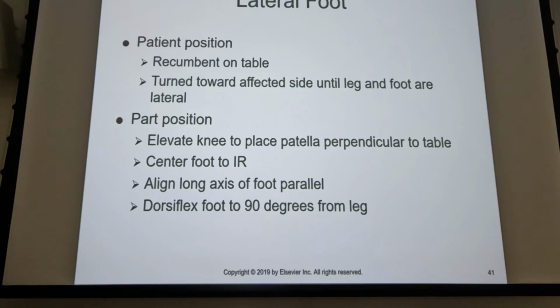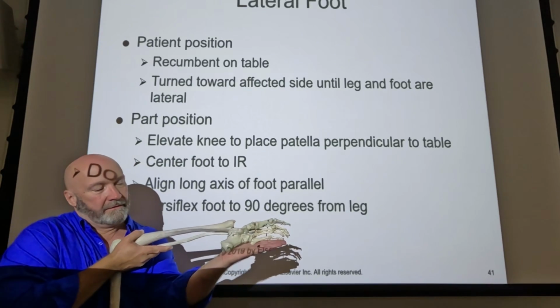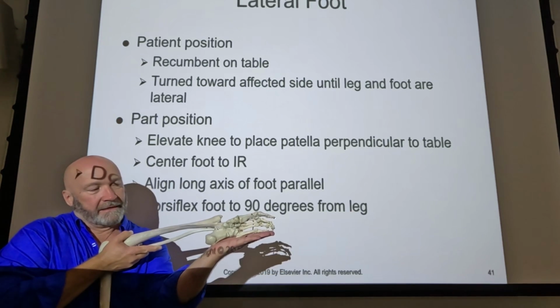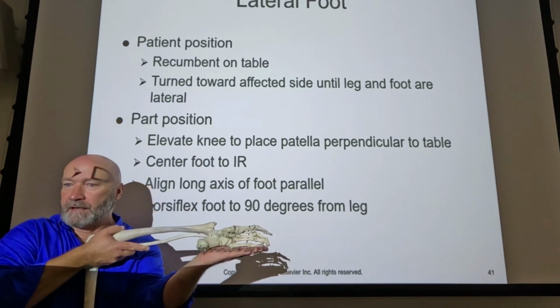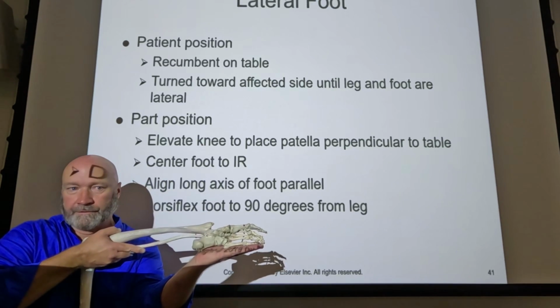All right, so what they're saying is that if you put the patient's foot down, you notice that because the heel is thinner than the distal portion of the foot, the medial side is at an incline. What they're saying is elevate it so that it does that. Okay, so the heel shouldn't be in contact with the image receptor.